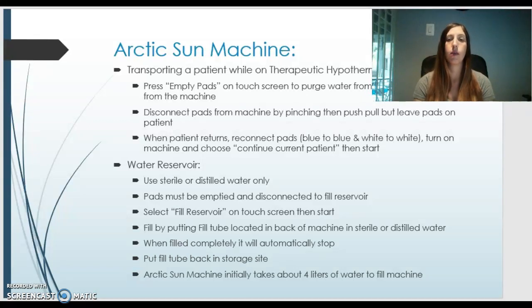Then you would disconnect the pads from the machine by pinching, then push-pull, but leave the pads on the patient. If you do not empty pads and purge the water, when you disconnect, water will spill out from the pads and make a mess. So you definitely want to remember to always empty and purge your pads and then disconnect the pads from the machine. But the pads stay on the patient and go with the patient wherever they're being transported.